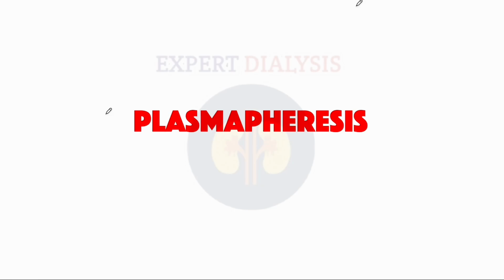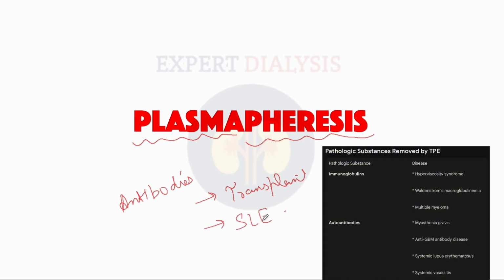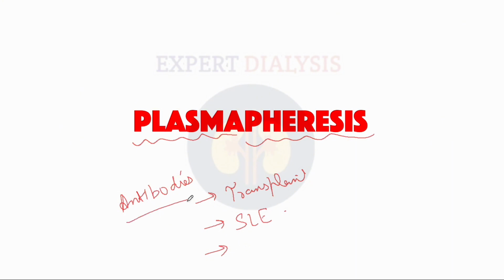So in this video, we are going to talk about plasmapheresis. Plasmapheresis is an extracorporeal therapy that we use in patients to remove antibodies which can further lead to transplant rejection, or we also use this therapy in patients with SLE, lupus erythematosus and other antibody antigen reactions. So we will dive into this topic and we'll see what this therapy is all about.